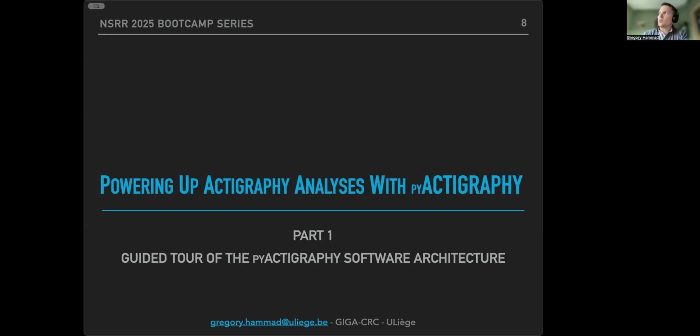That might be useful because, if you have questions, we have set up an online documentation on different functions, but sometimes you really need to understand how the architecture is set up, so that you can dig into it and find a solution yourself if there is a function that you want to use which doesn't contain the right information.